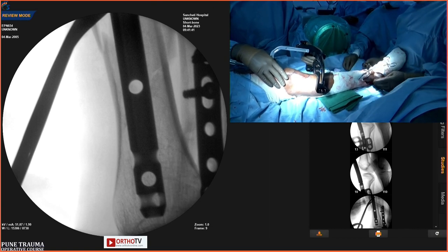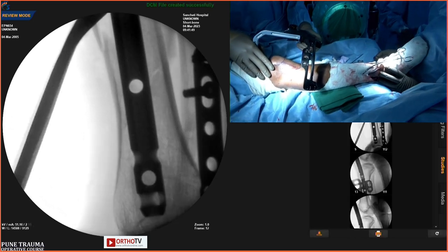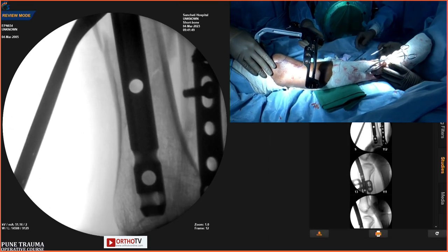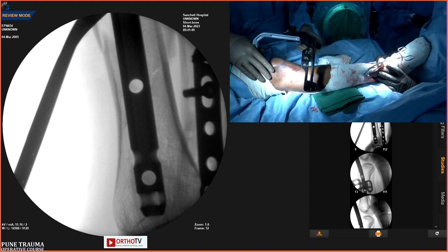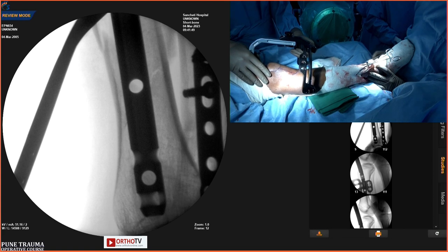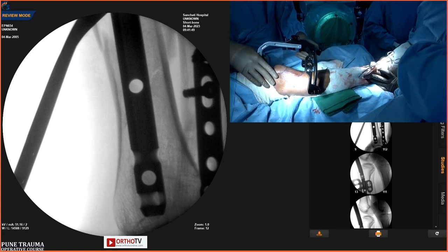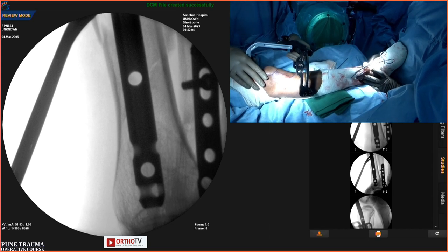What has happened here is, if you see, the fibula fixation has just two screws proximally and two screws distally. We have not yet finalized the fibular fixation. It was just a temporary fixation of the fibula. That's exactly what I'm trying to explain to the person who has asked the question. So how did he measure the length of the nail? We will revisit the fibular fixation.